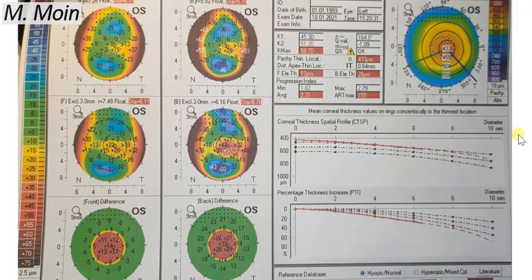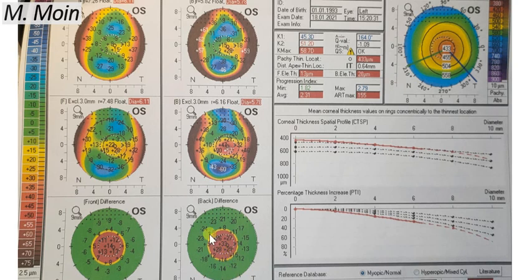On the Belin-Ambrosia Enhanced Display for the left eye, the normal and enhanced elevation maps are shown for both front and back surfaces. The posterior surface shows a more significant conical shape than the anterior surface. The enhanced elevation values are plus 14 anteriorly and plus 35 posteriorly. The D value for this eye is 7.81, compared to approximately 6-point-something in the right eye. The pachymetry progression index shows thickness increasing from 400 microns centrally to 600 microns peripherally, but the percentage increase is out of the normal range, definitively confirming keratoconus in this eye.